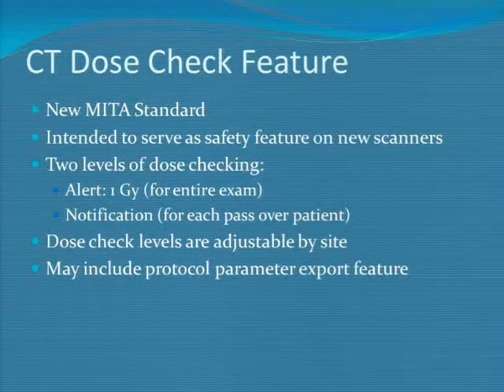These dose check levels are totally adjustable by the site. The flexibility of them really depends on the vendor. Some let you just put a straight value in. Others let you use sort of a ratio, a factor for this notification value. They're all just a little bit different.